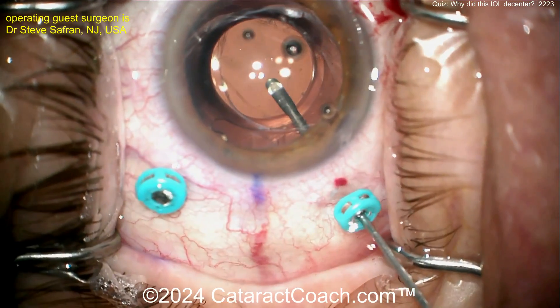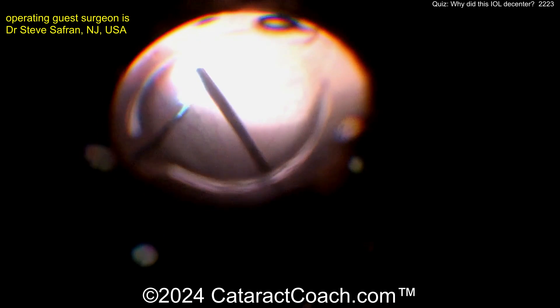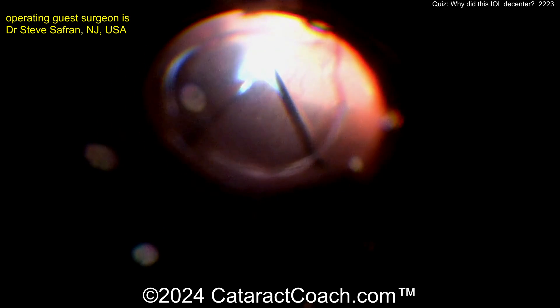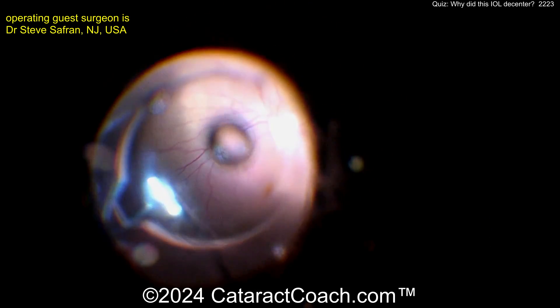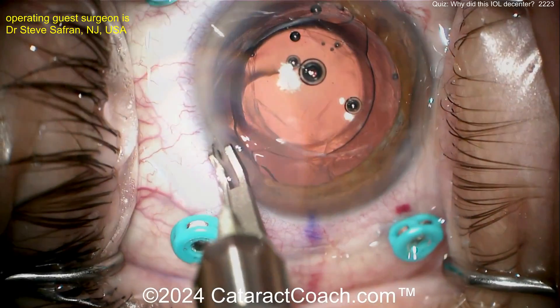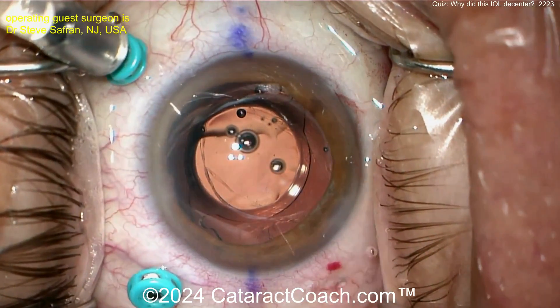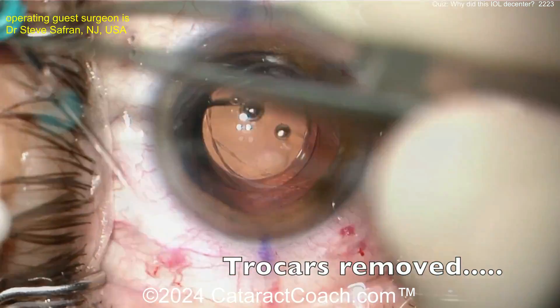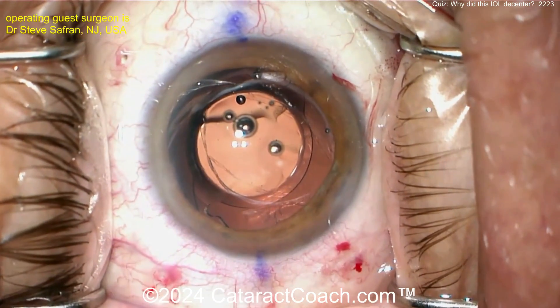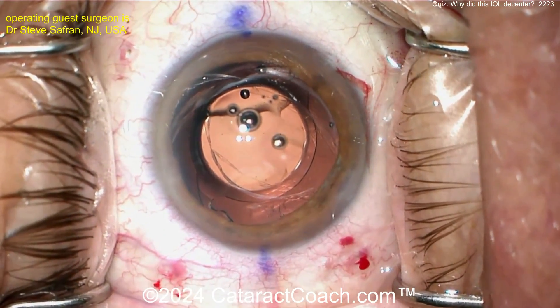This case has been beautifully managed. Look how nicely it's cleaned up after the full vitrectomy — the Weiss ring is gone and the patient won't have any more floaters. Just a really beautiful surgical result. The patient has a beautiful outcome the next day. A small LRI is done to treat the astigmatism — remember, don't leave any stone unturned. The trocars are removed and the wounds are sealed.